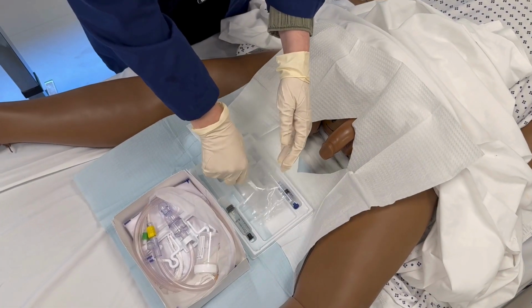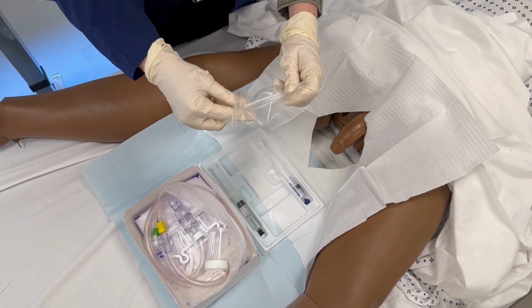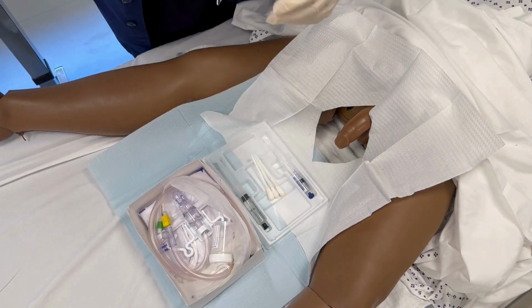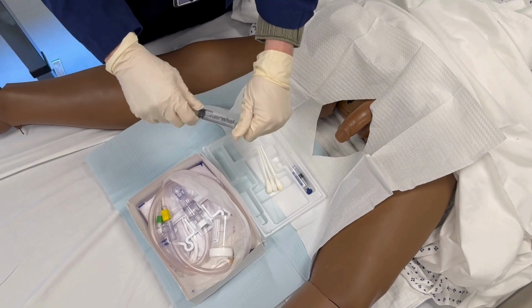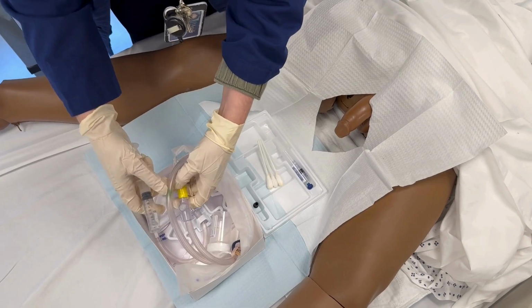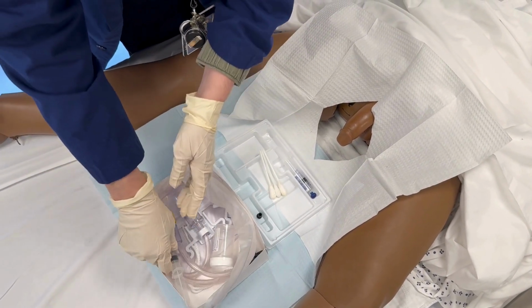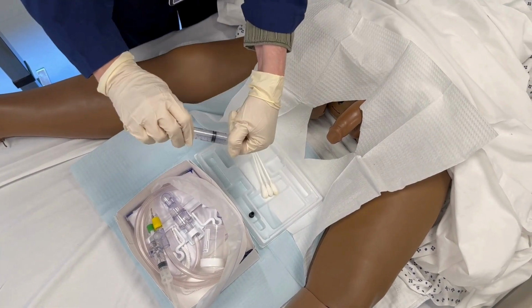Open sterile cleansing solution. Attach syringe filled with sterile water to the catheter's balloon inflation port. Deposit lubricant from syringe onto tray.